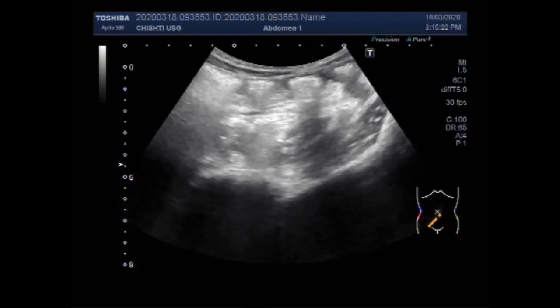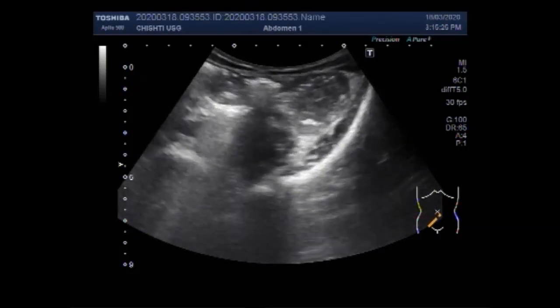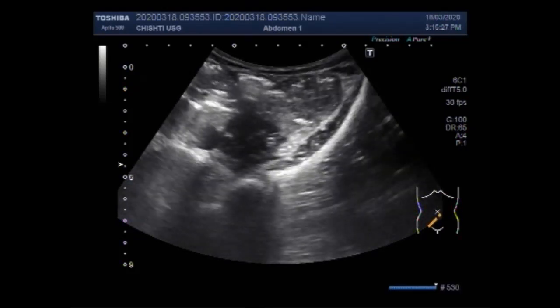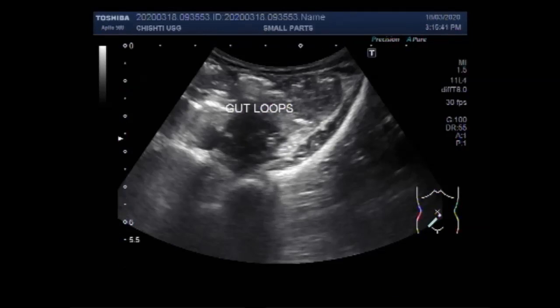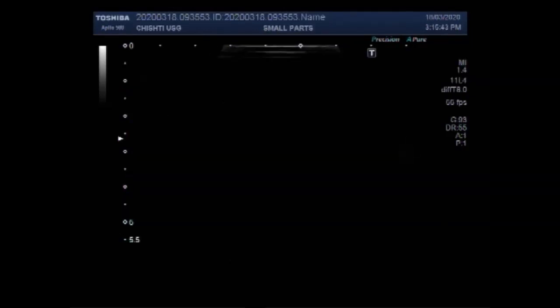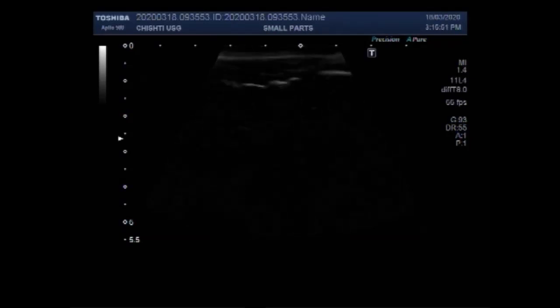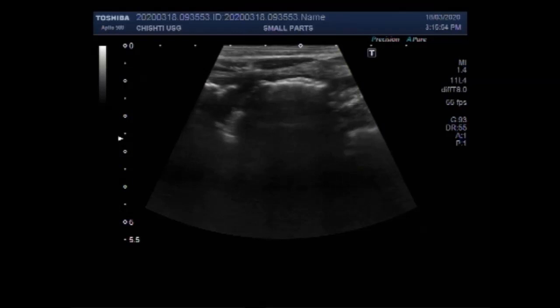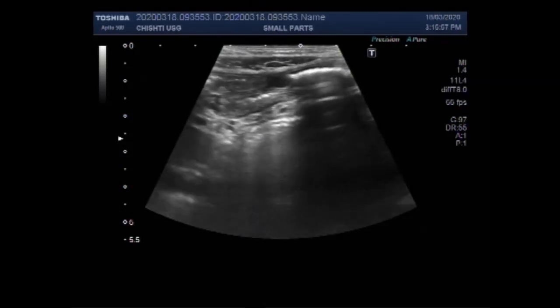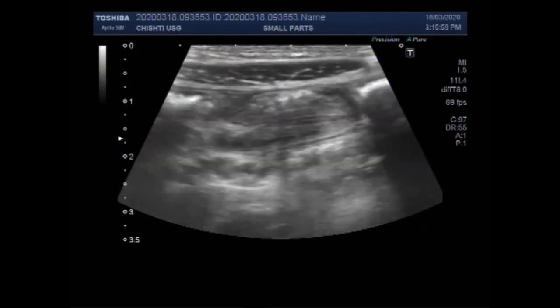You can see the gut loops of this patient, and there is intestinal obstruction. The movements of the gut loops are very restricted with minimum motility. The patient has not passed flatus or stool since the last 36 hours before the examination, and there is minimum intestinal motility visible.